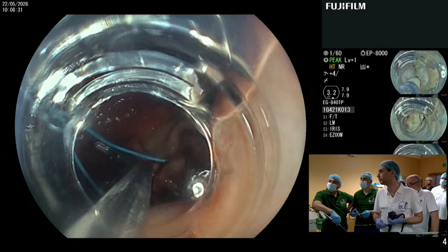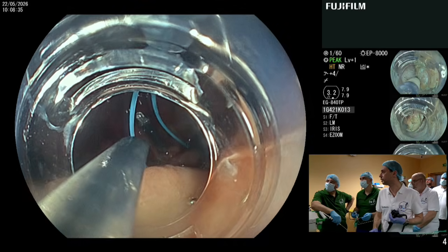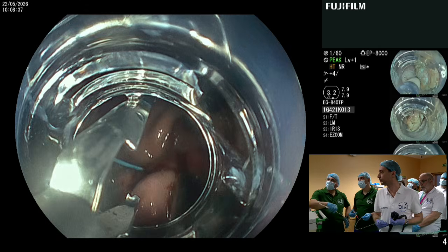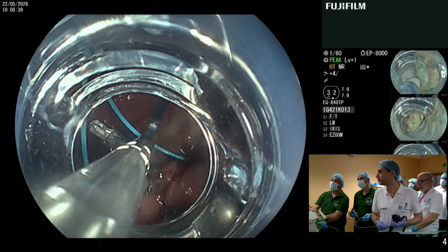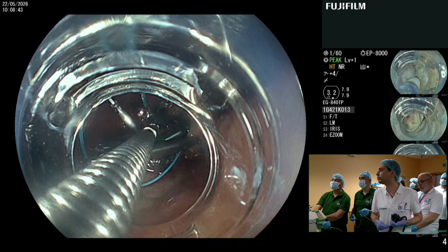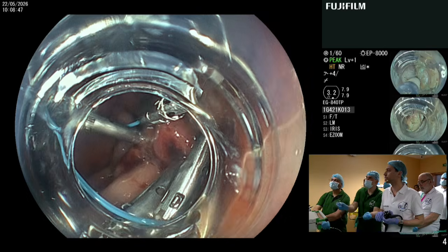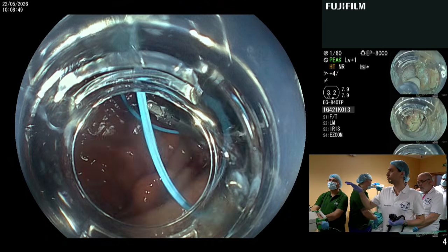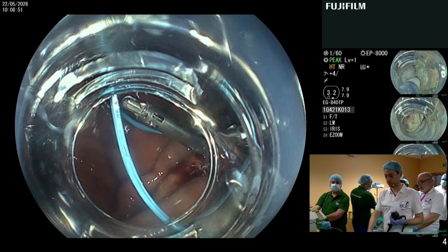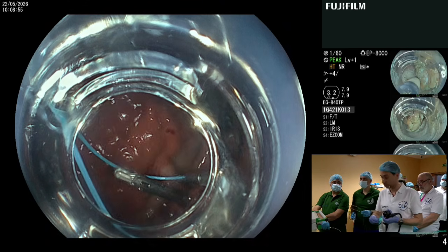Open. Okay, so we have to be very careful. All right, here. All right, place it. Open. Open. Okay. Close. Place. Fire. Yes. One more. Next clip, please. One in the left, one in the right. Yes. So, we attach multiple clips around our defect.